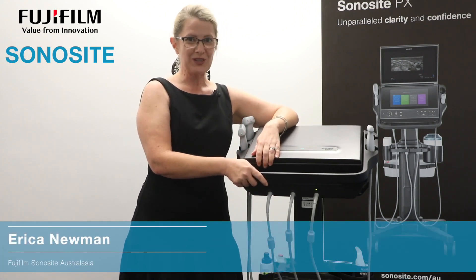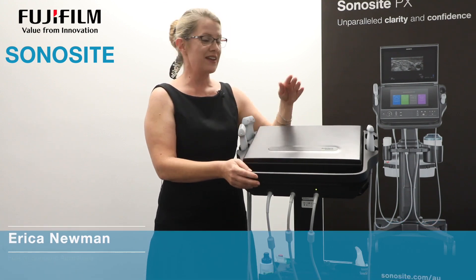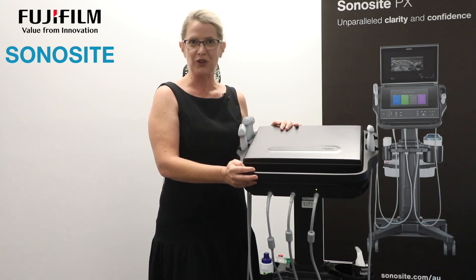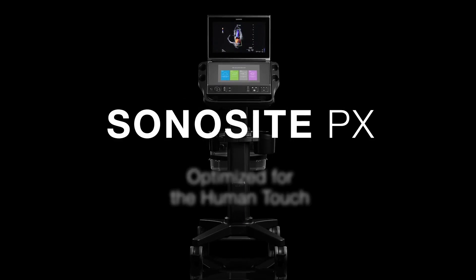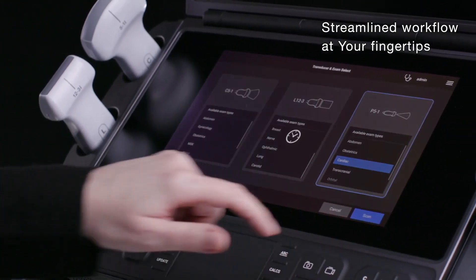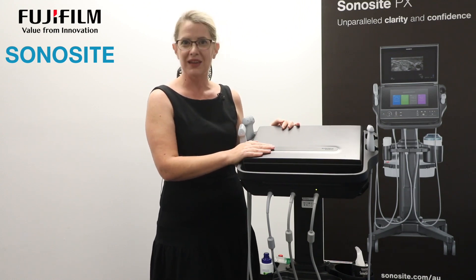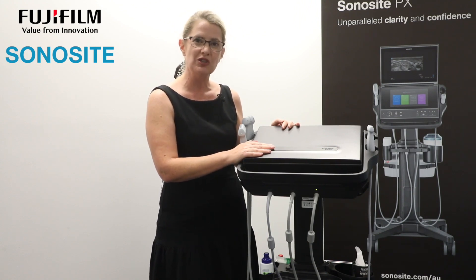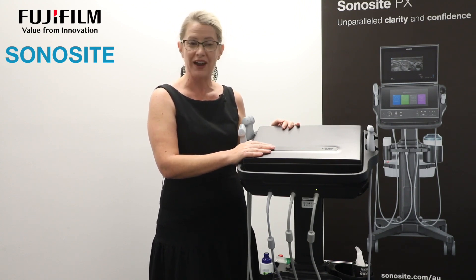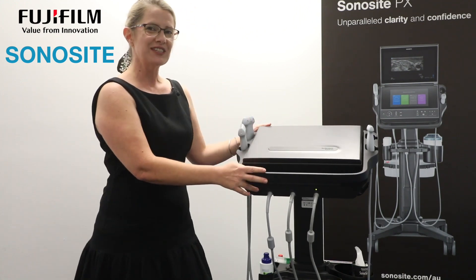I'm Erica Newman from Sonosite Australia New Zealand, and today I'm going to be introducing a brand new addition to the Sonosite portfolio: the Sonosite PX point of care ultrasound machine. It's been completely re-engineered — new technology from the wheels up — because we asked our clinicians what they would want to make better and what we could do to improve their day-to-day workflow.